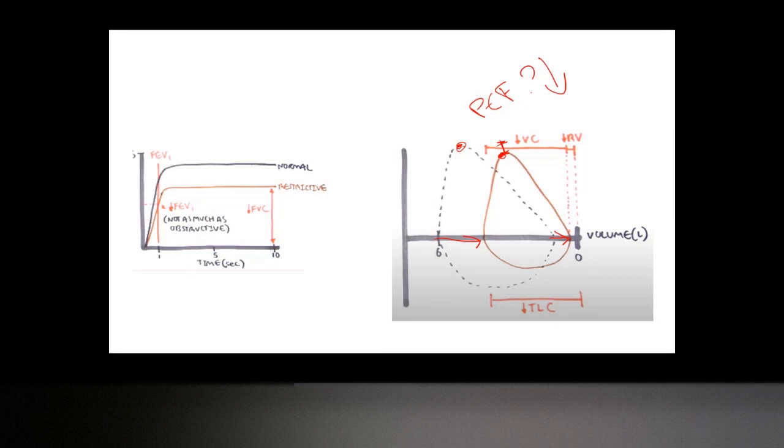Because the elasticity is increased. Elasticity, well, you have the right thought process, but not the elasticity, because it's fibrosis. Okay, yes. If the elasticity has increased, the compliance would decrease. No, wait, compliance would decrease. But what I'm asking is why the PEF won't change, it's approximately the same in this case? Any idea why? Oh, sorry. Go ahead. No, you continue.